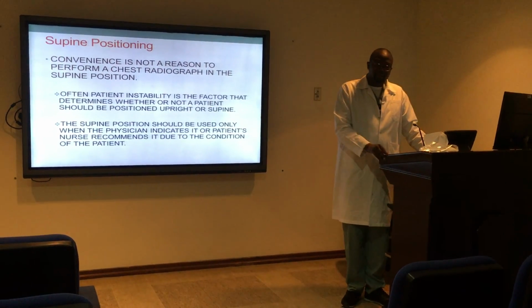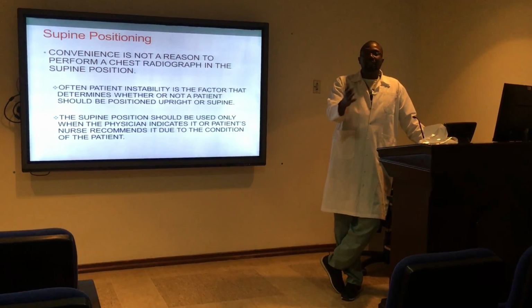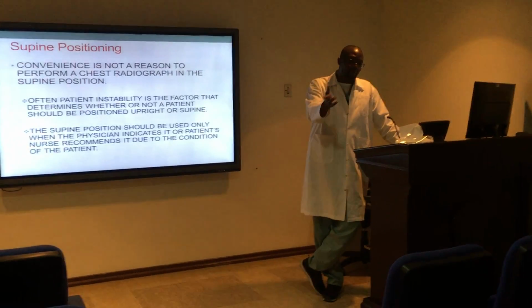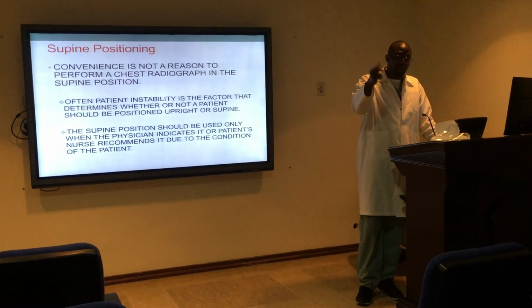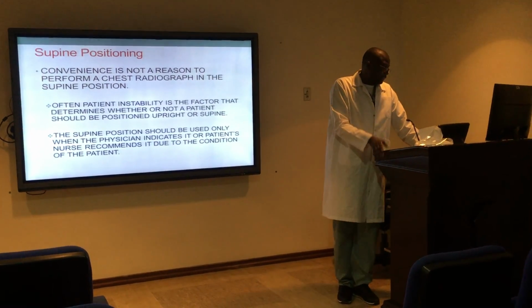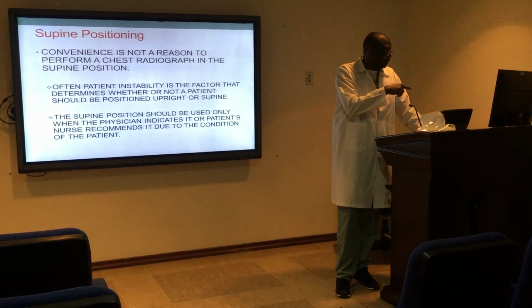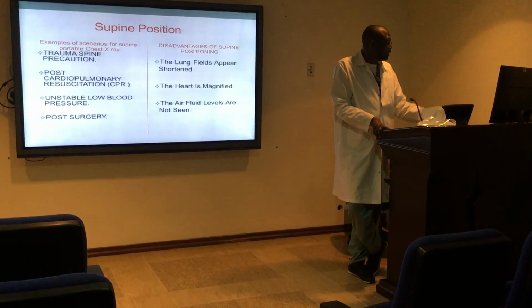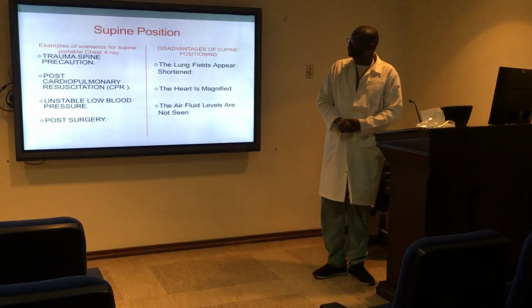So always remember, supine should be the last option when you are doing portable X-ray. I will explain this in the next or the second next slide. Okay, exactly. So I will quickly just go through this for you.